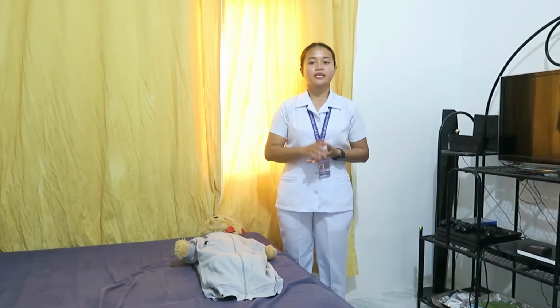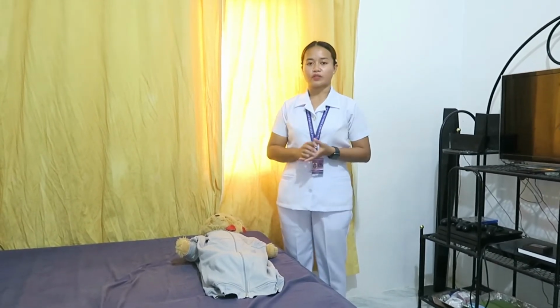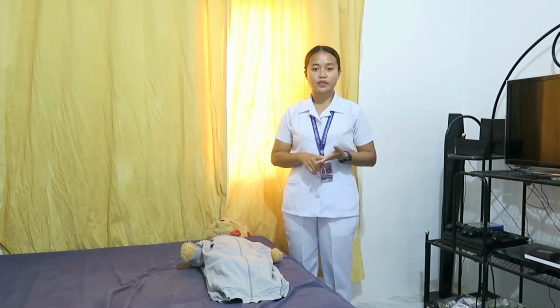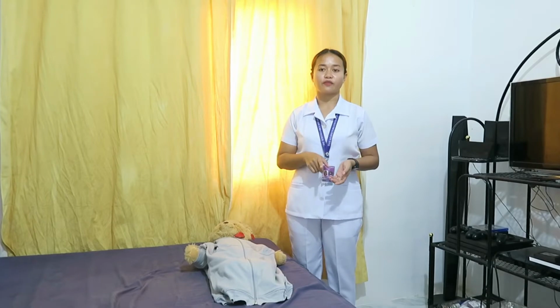So, let's assume that there is no pandemic as of the moment and you are walking since it is your day off, near the hospital you are working at, when a citizen suddenly collapses. As a nurse who witnessed the cardiac arrest, you need to take the first action. So the first thing for the adult CPR is the assessment and activation.